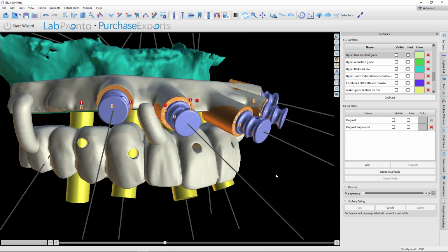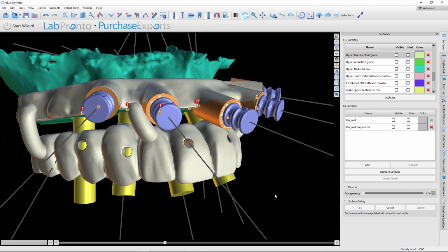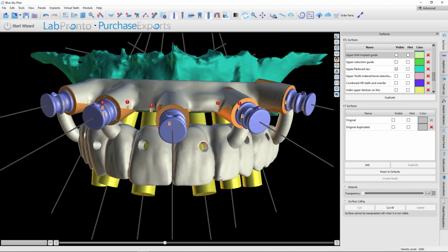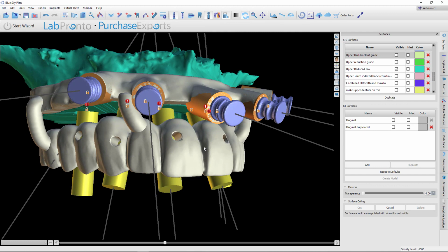So we don't want to sew everything up and then try to seat this. This already has the correct pontic profiles, distance from the bone and everything. So instead, deliver this, and then when it's all delivered, suture the tissue to this, and it's going to take the shape of the underside of this restoration. And these teeth will look like they're emerging from the gums naturally.